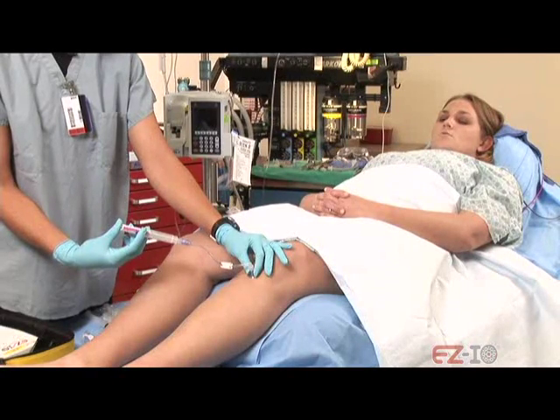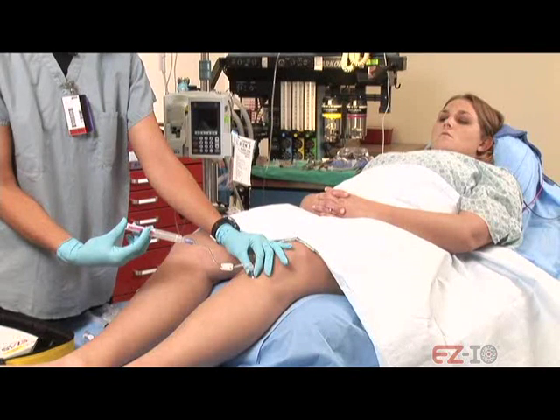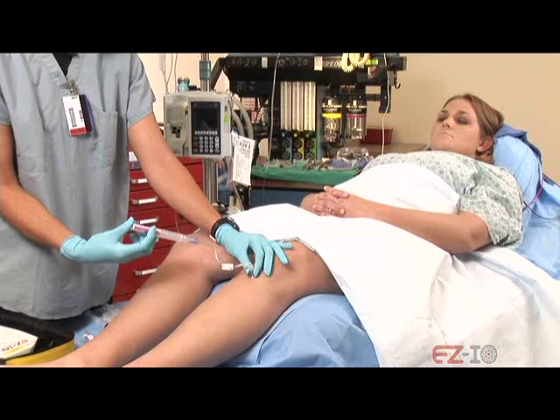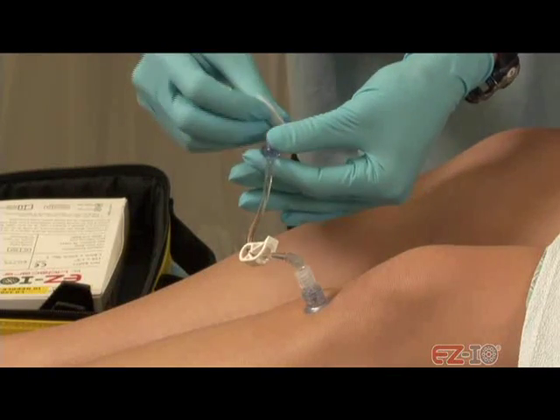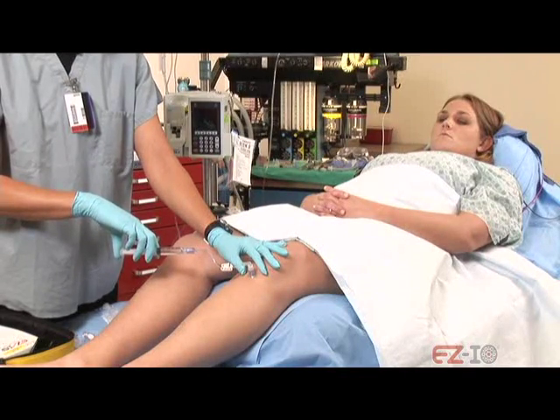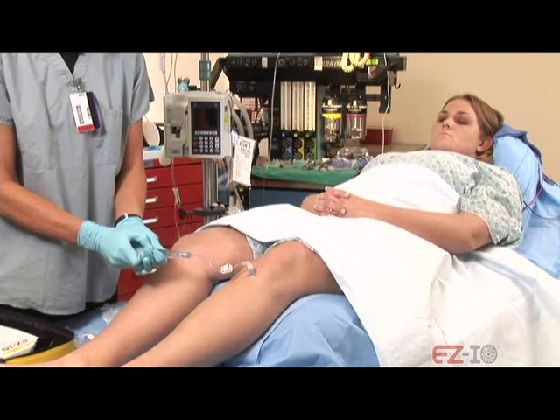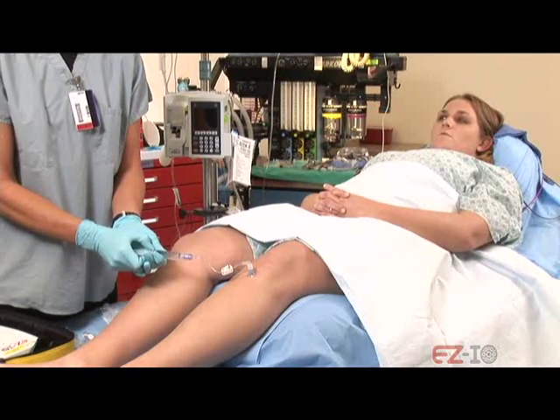And now? Like a 3. And now? 3. Still doing okay? What's your pain level at now? Now again, we're just going to go slowly here. Doing okay? Still doing okay? What's your pain level on a scale of 1 to 10? Like a 4.